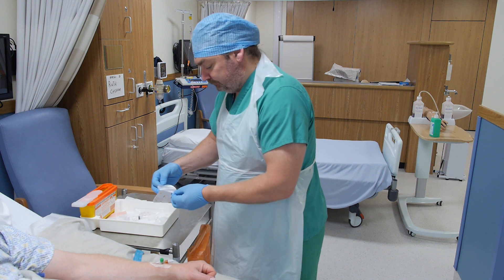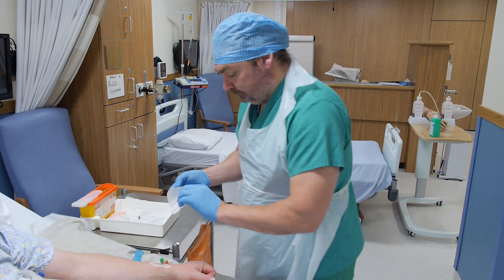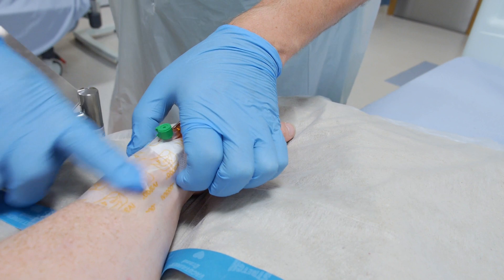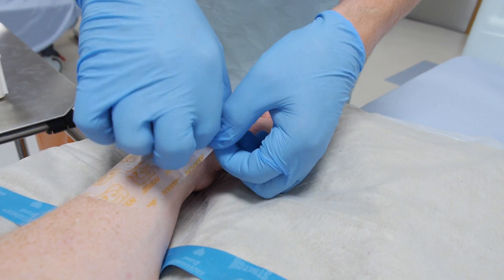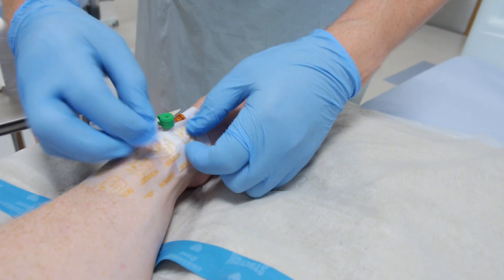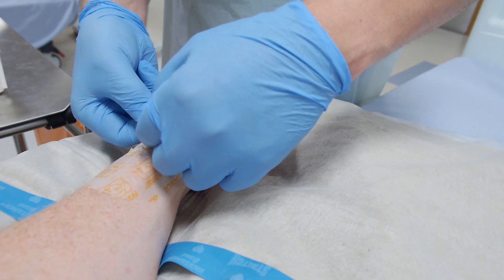Apply the remainder of the dressing as shown and ensure that the transparency covers the insertion site. Remember to date and sign the supplied annotation strip and don't obscure the insertion site.